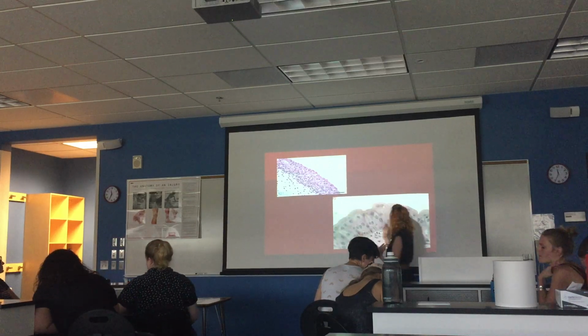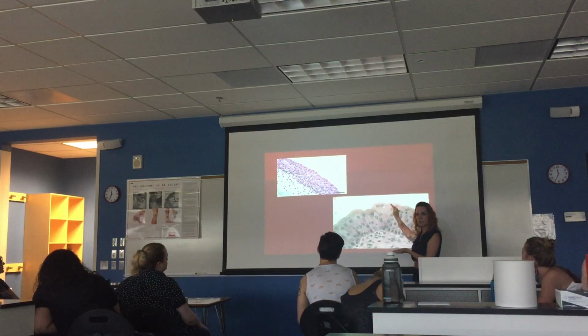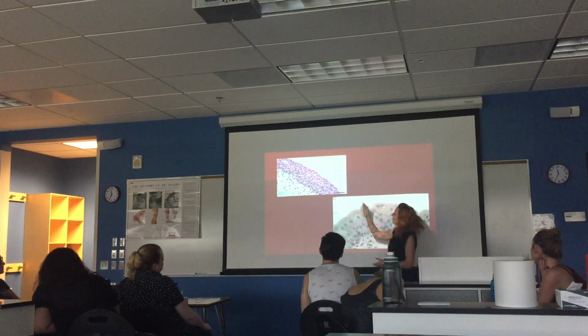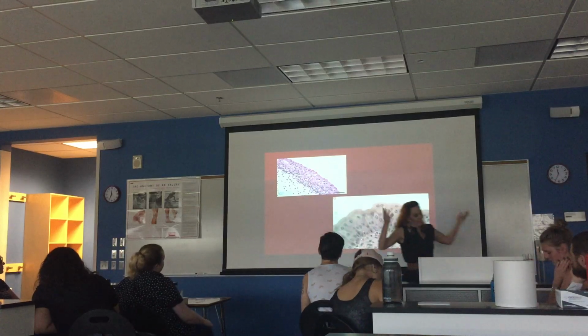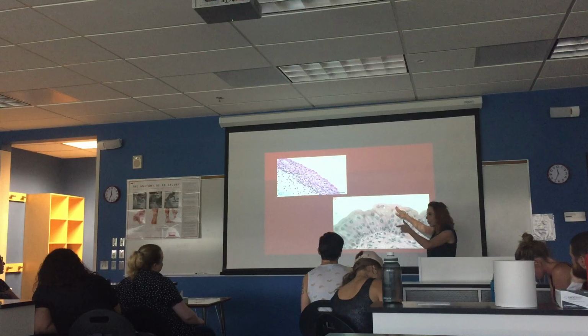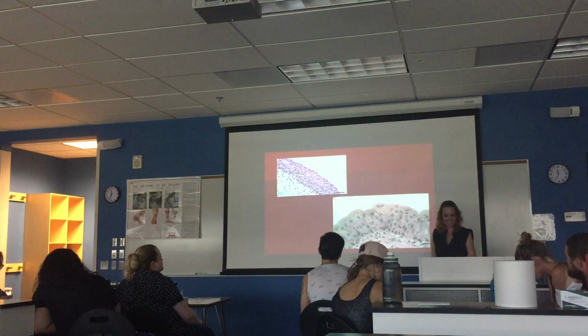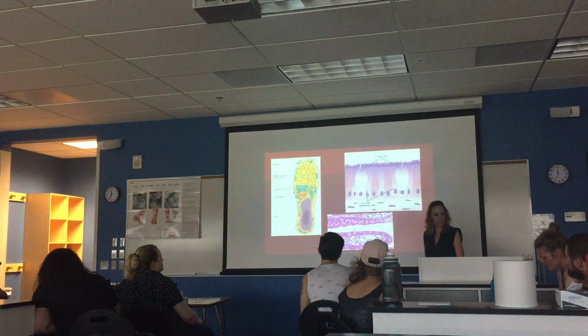To me, it's more clear because the epithelial surface is bubbly. It's not smooth and consistent. It's like, I don't know, bubbly. And I can see the basement membrane, and I can see there's multiple layers, and I know intellectually that there's nothing else that it could be other than transitional. Let's skip over all the gland stuff for now.